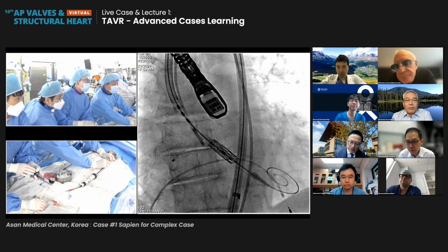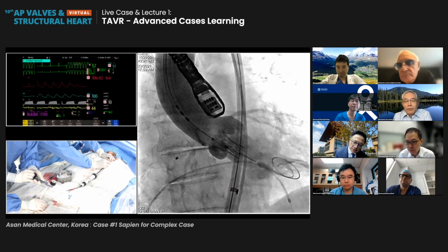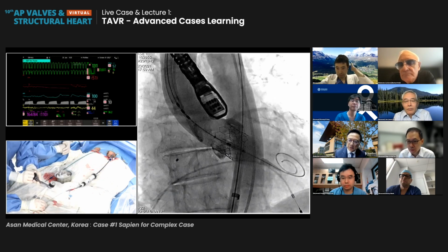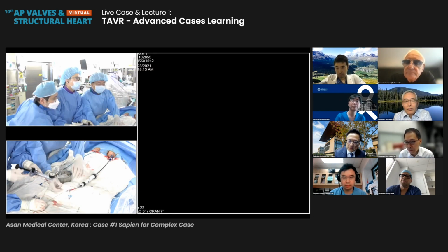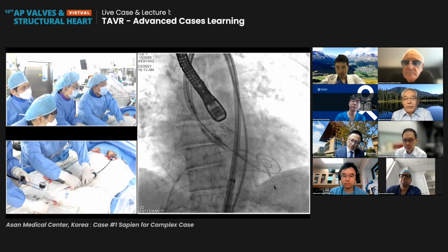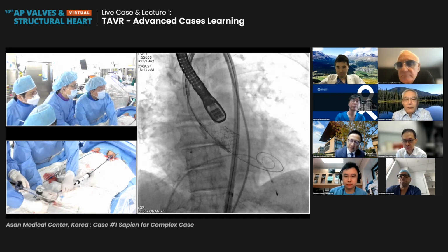Okay, going to do it. Ready, pacing. Okay, contrast, please give enough. Okay, inflate. Inflate. Good. 1, 2, 3, 4, 5. Deflate. Inflation. Okay. And device out.